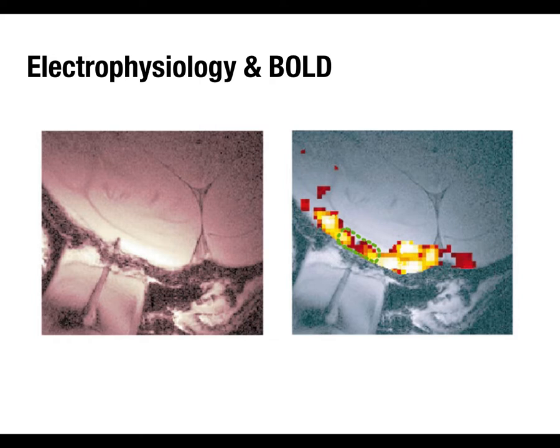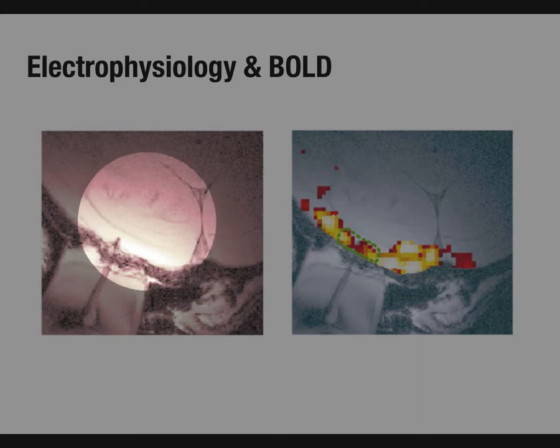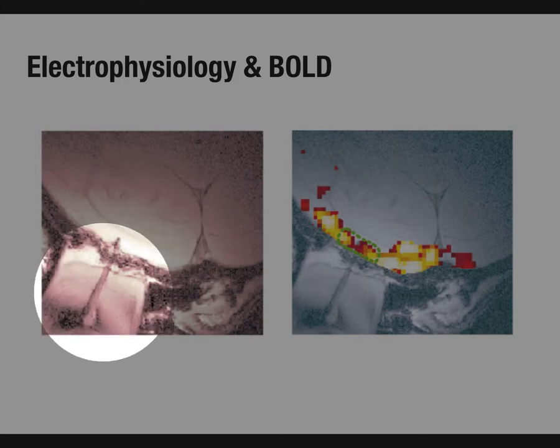And so a lot of work just to get this data, and then just doing simple visual stimulation. What you see here is the occipital lobe. That's the midline, so this is the left occipital lobe here. This line is the electrode, and all that stuff around it is the fixative that holds the electrode in place. So they've got an electrode stuck into the occipital cortex.